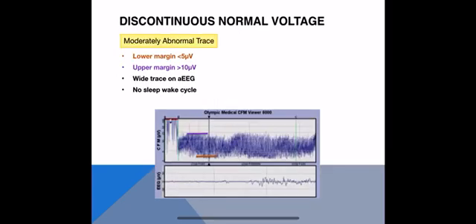This trace shows discontinuous normal voltage, which is moderately abnormal. Although the upper margin is greater than 10 — again the purple line — the lower margin is less than 5, so it has dropped down and the trace has a much wider appearance. Also note that there is no real presence of sleep-wake cycling; the trace is much broader and wider throughout.